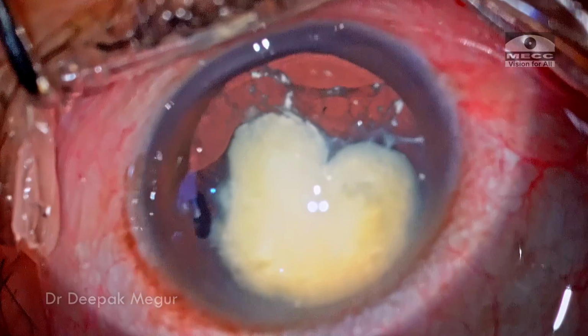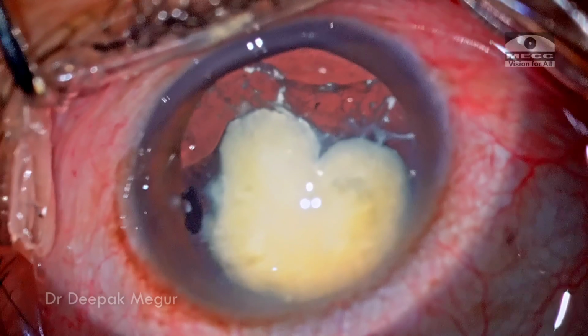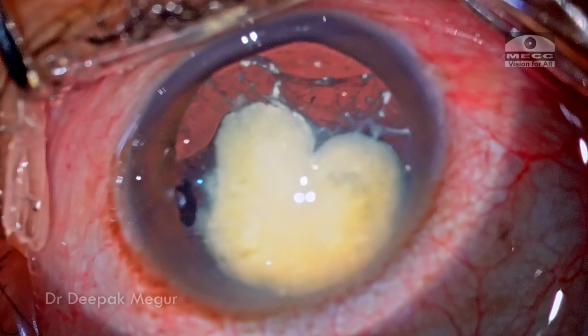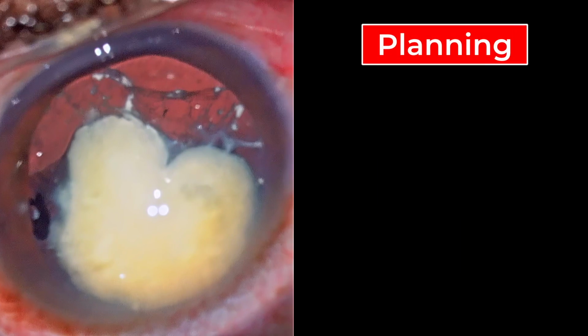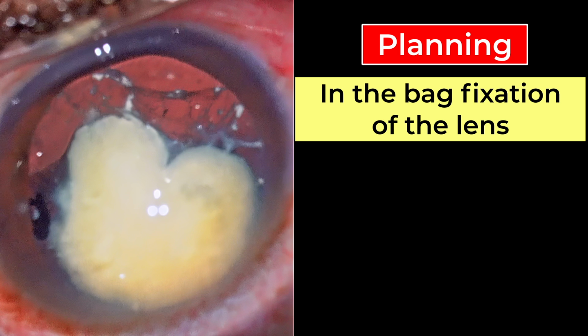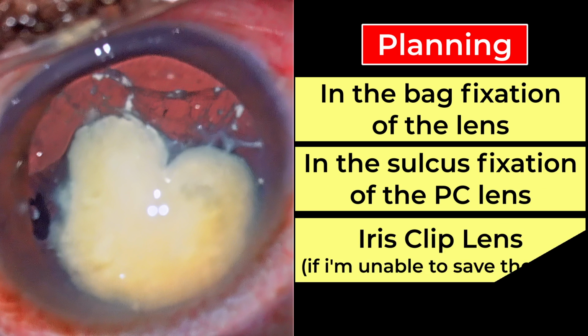Let me take you through the things which were running inside my head. In these cases, every option has to be kept open because traumatic cataracts are like Pandora's box. You never know what you're going to get inside. So to begin with, I have planned for in-the-bag fixation of the lens. I have planned for sulcus fixation of a posterior chamber lens. And I am also ready with an iris clip lens if the bag cannot be salvaged.